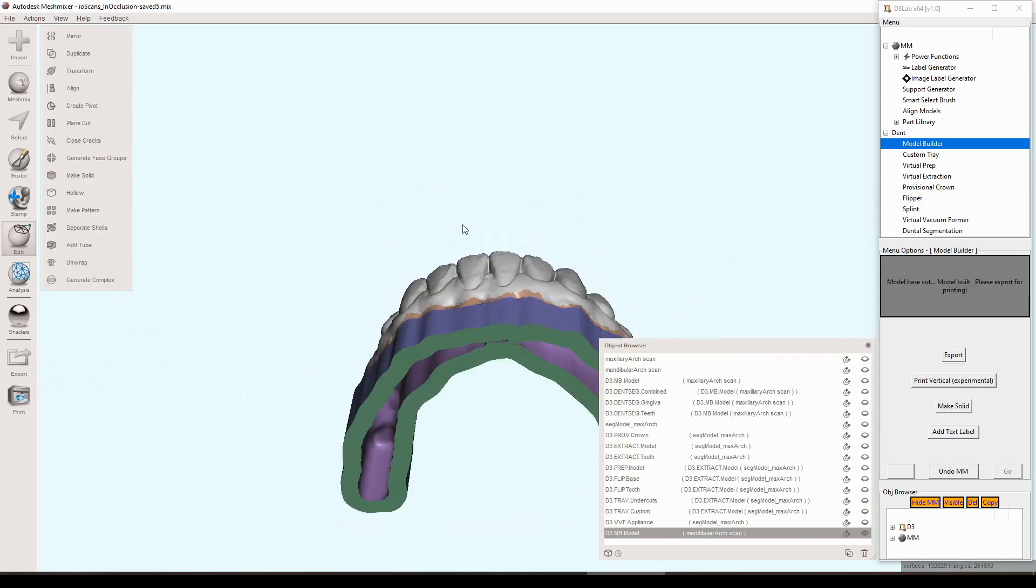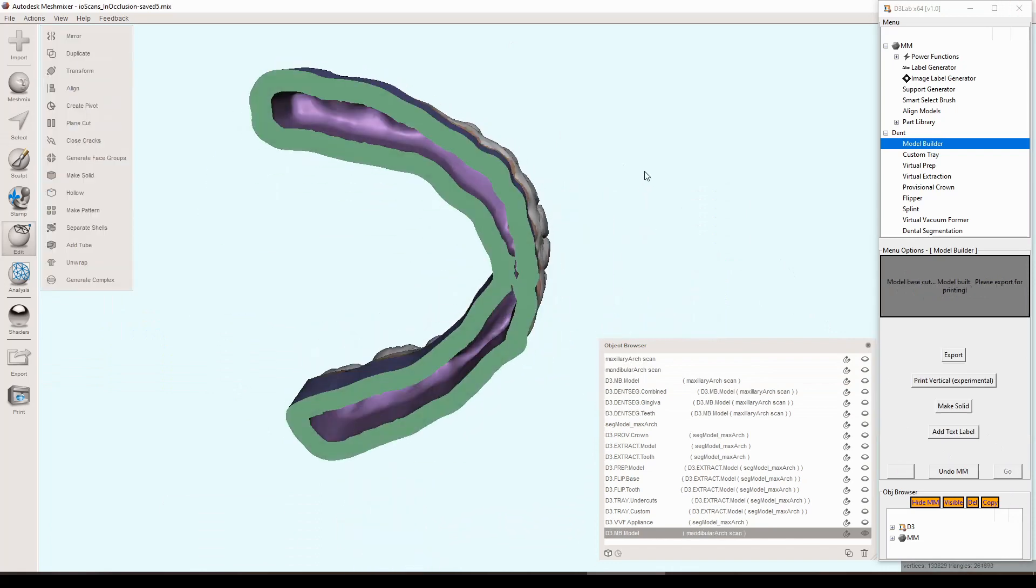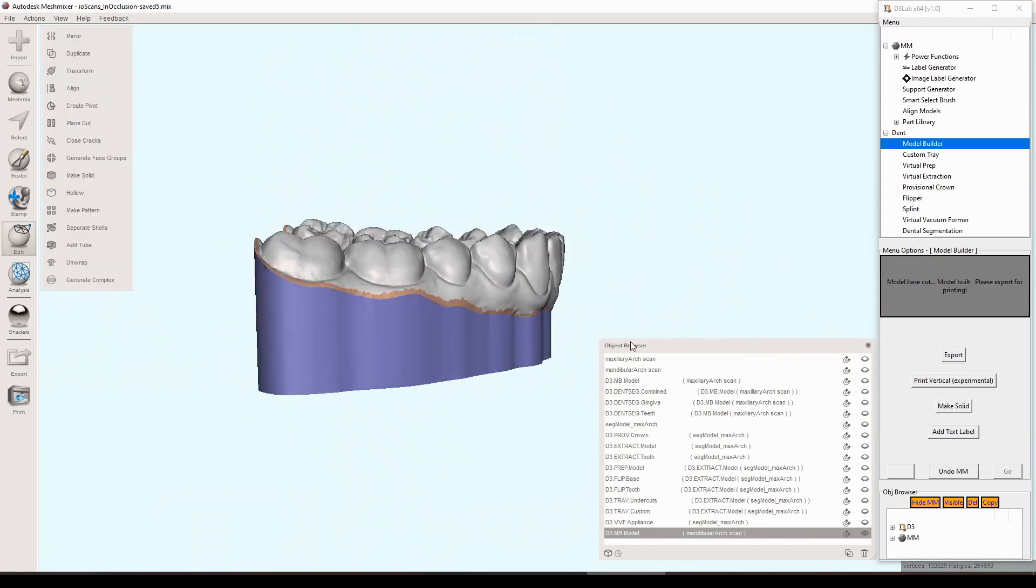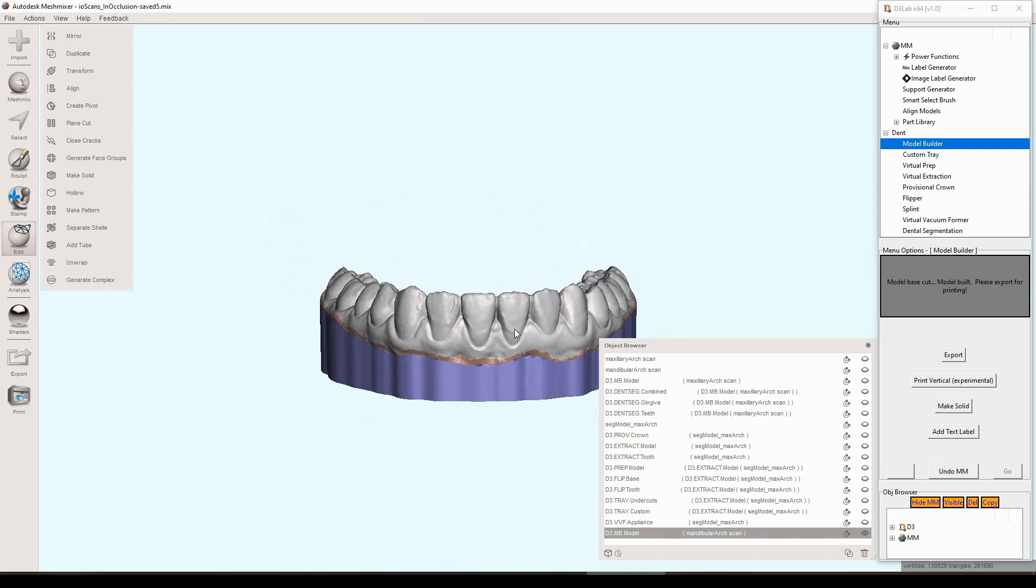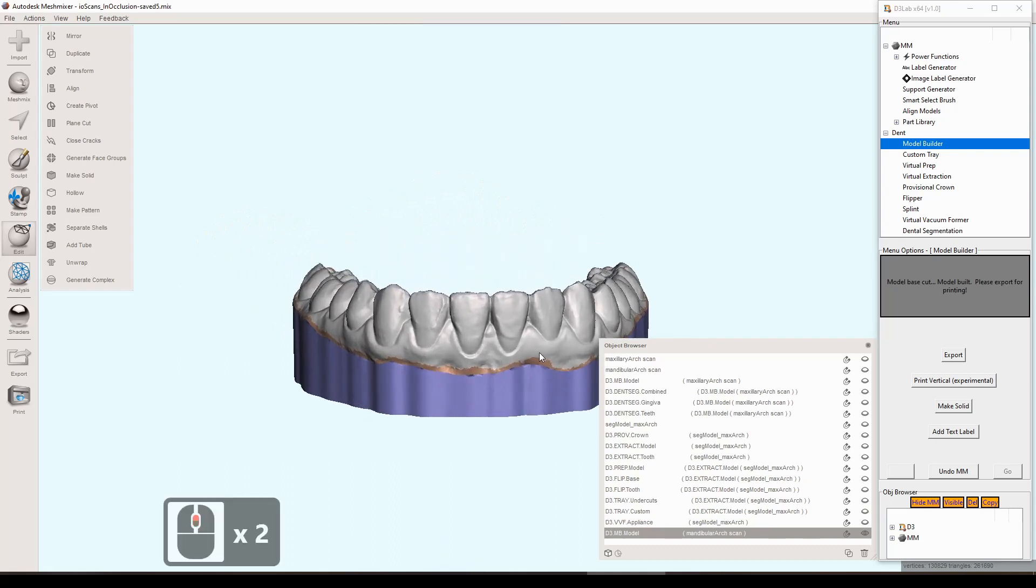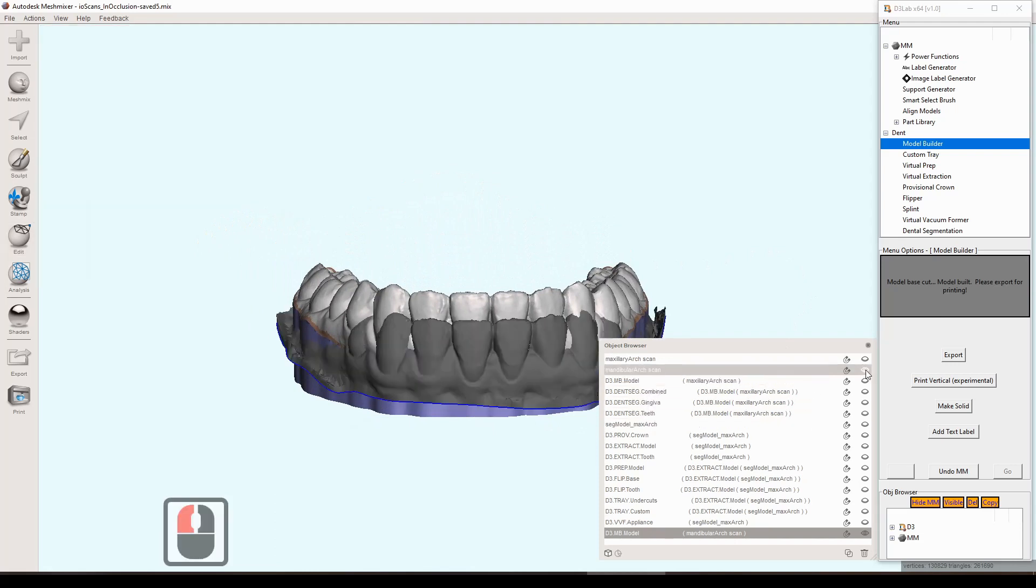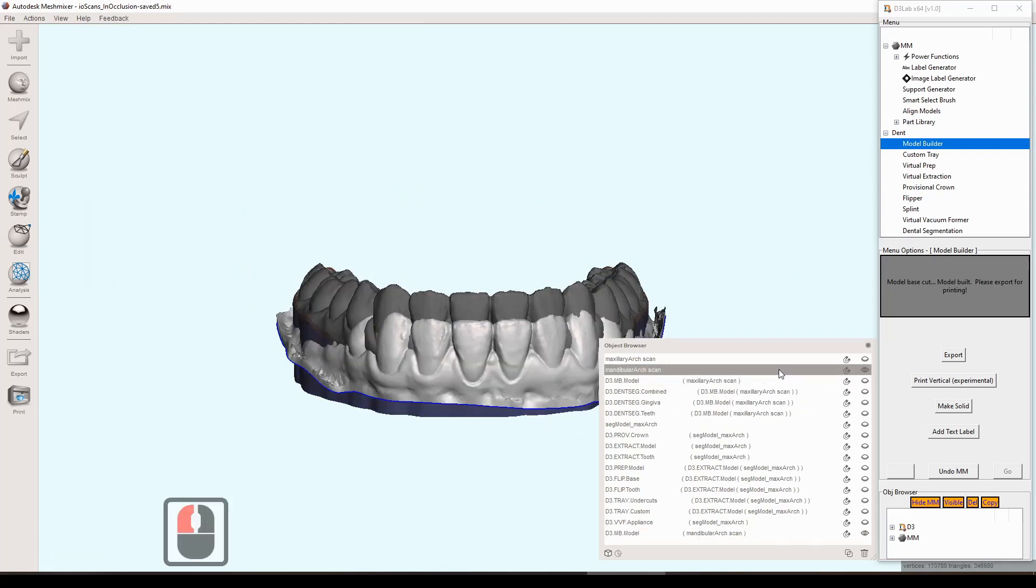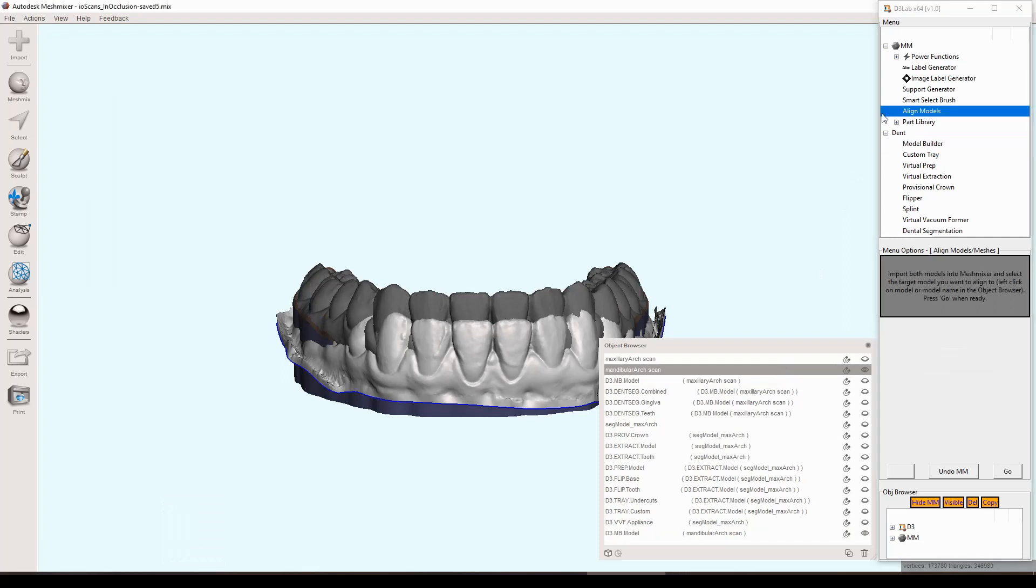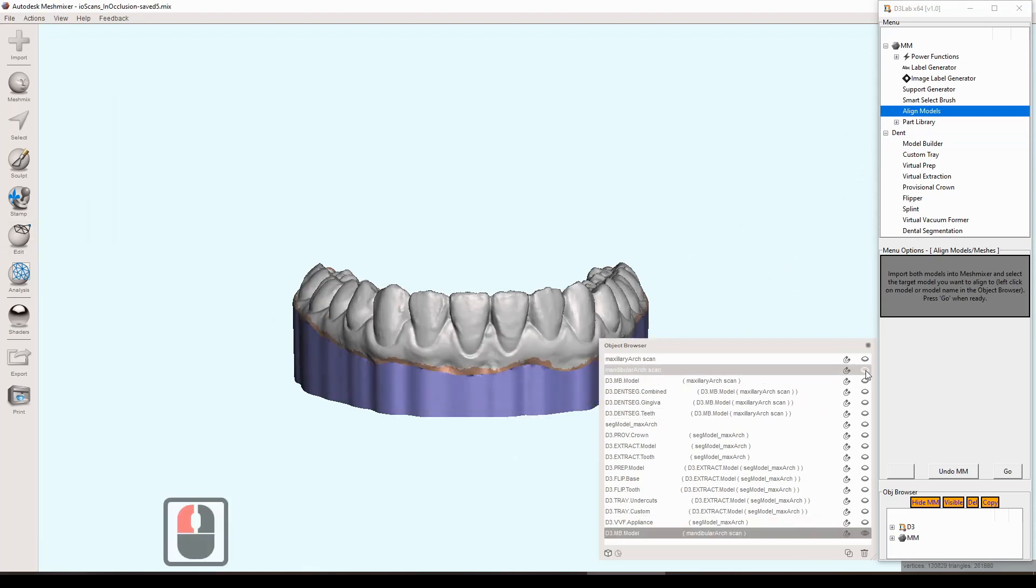The model has been built and this time we chose to do a hollow. It looks good. If we were wanting to get this model back into its original occlusion we could run the align model tool like we did in a previous video, but for this particular video we're focusing on the image and text label generators and the 3D print support generator.